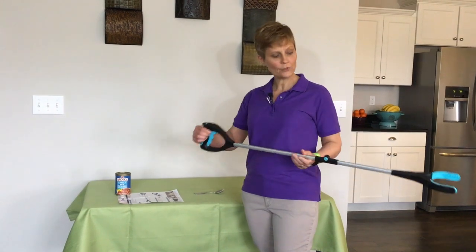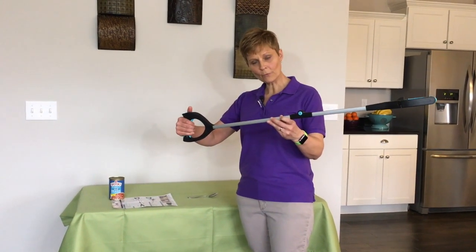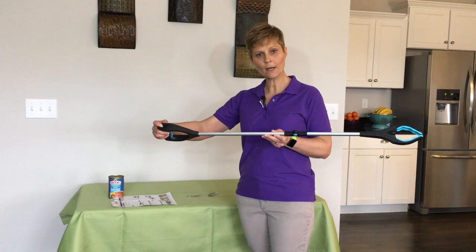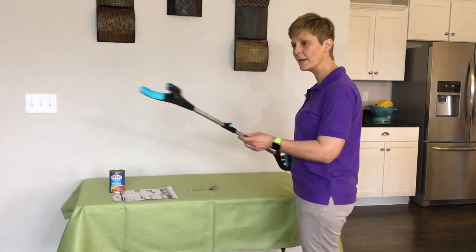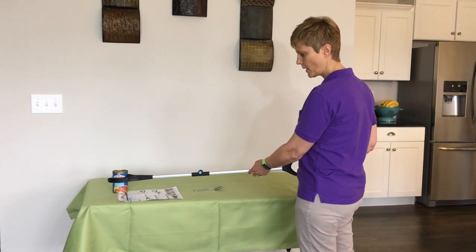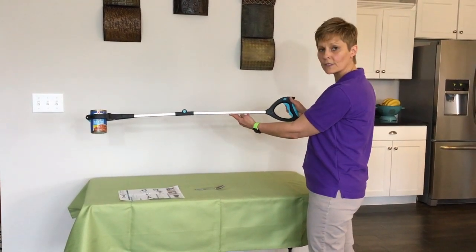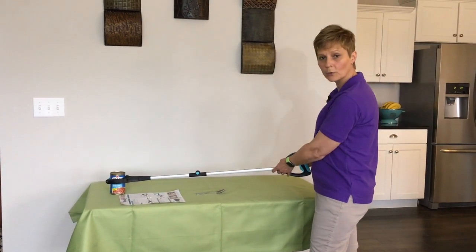So now that it's in the ratcheting mode, you can hear when you grab — it ratchets the end of this shut. The way you release it is this little blue button on top right here, and that will release it. Let me demonstrate again grabbing this can. I put it around here — you can hear the ratcheting. I ratchet that and now I'm not having to hold on as I lift this can. And to release it again, I'm pushing this little blue button at the top.